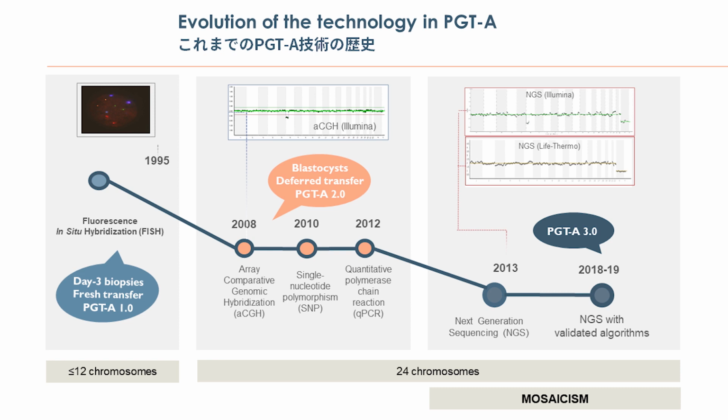So these are the improvements that we have made in our PGT-A protocols in the last 2 years, working at the bioinformatic level.